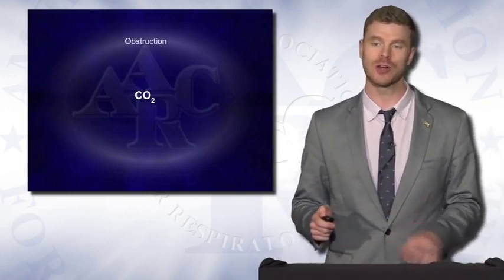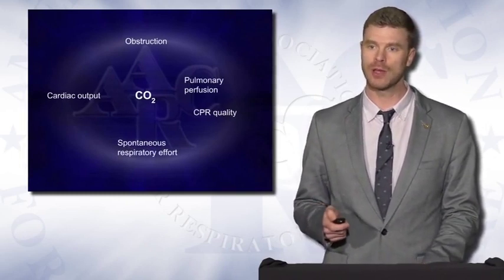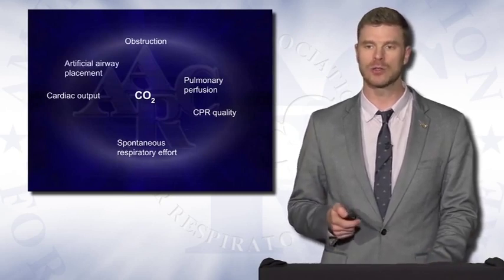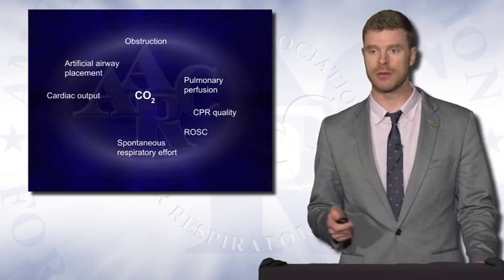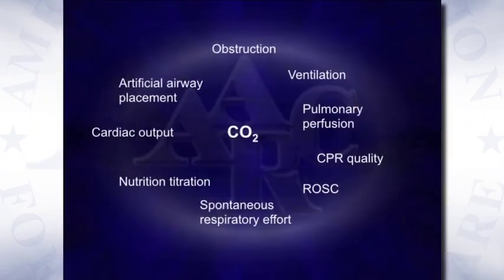So CO2, it's a wonderful molecule. Monitoring CO2 can tell you a tremendous amount of information about your patient, which is, I think, a blessing and also a curse. Anything from obstruction of the airway, CPR quality, cardiac output, spontaneous respiratory effort, pulmonary perfusion or changes thereof, artificial airway placement, verifying endotracheal tube placement, quality of CPR as well as return of spontaneous circulation, ventilation titration, as well as nutrition titration. As you can see, this is not a comprehensive list, but there's a lot of things on this slide that I think you can appreciate CO2 monitoring will play an important role in this patient population.